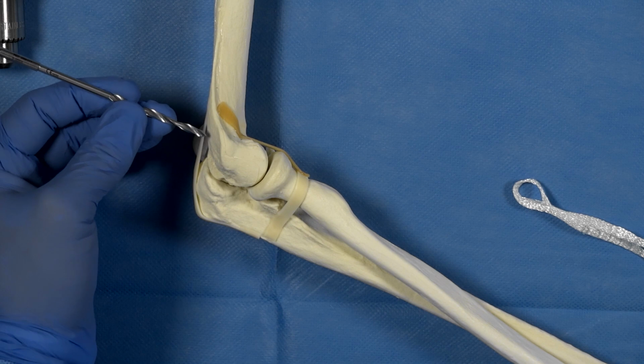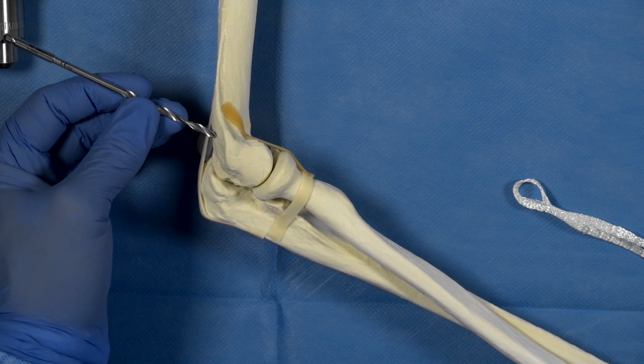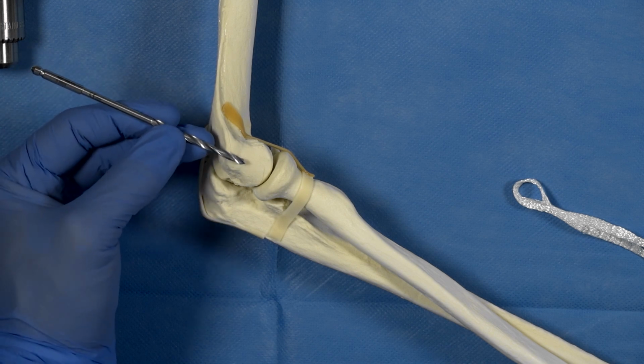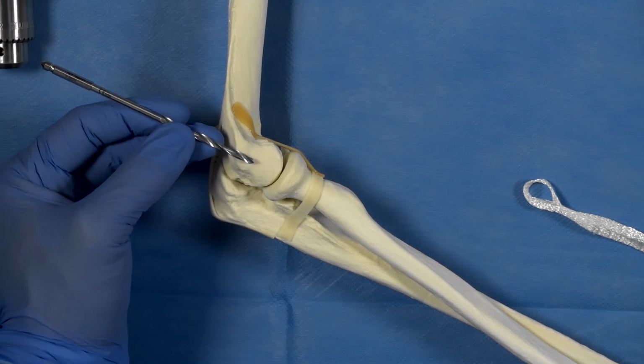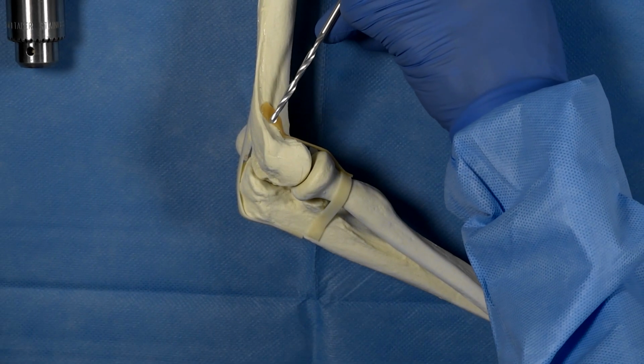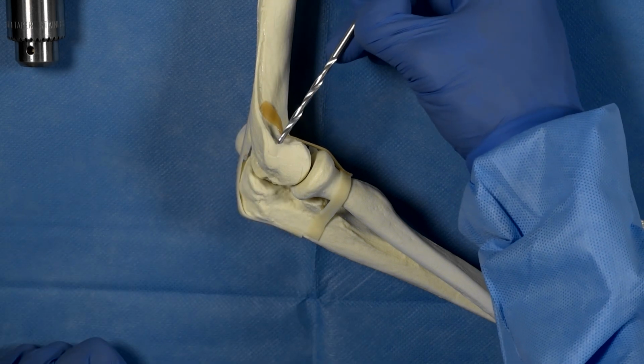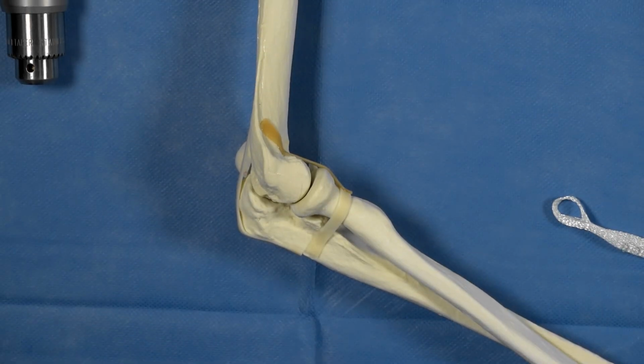We'll then create a drill hole coming from posteriorly and proximally to connect to our docking hole, and then we'll create a second anterior hole, so these are going to connect as a Y through the distal humerus over the lateral condyle.